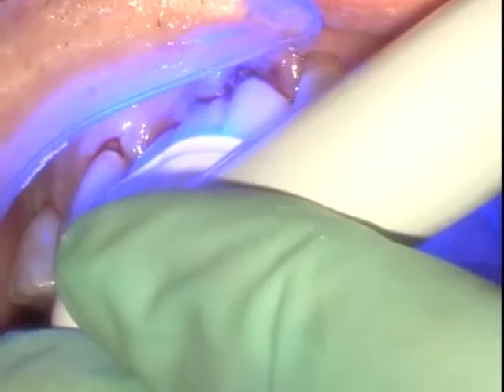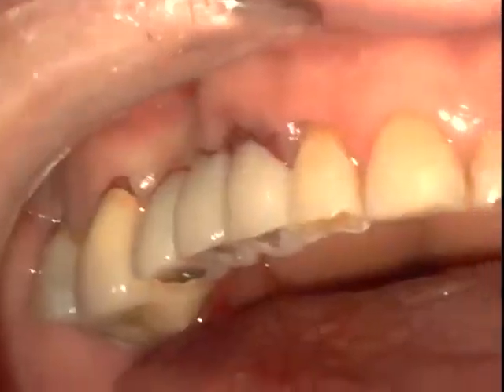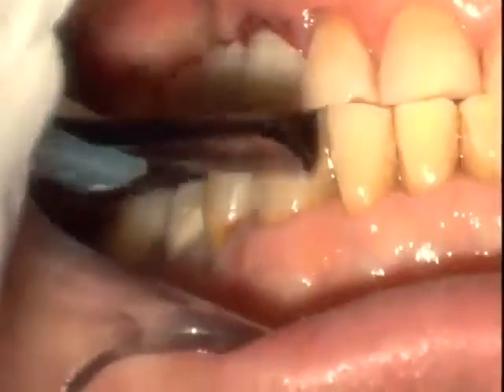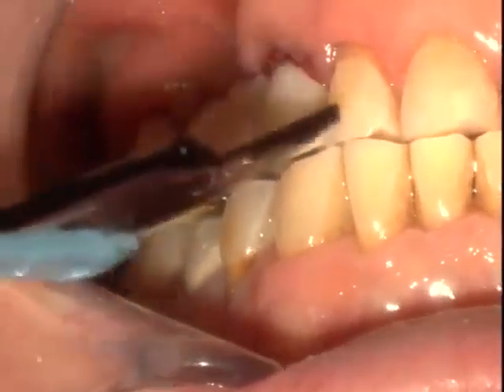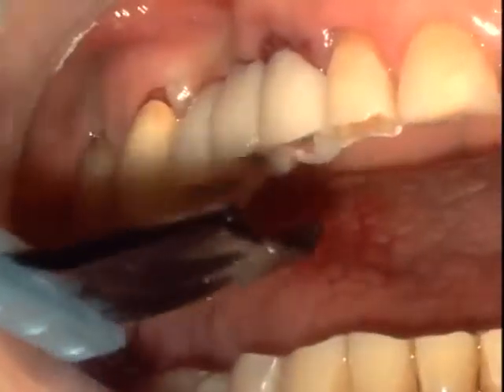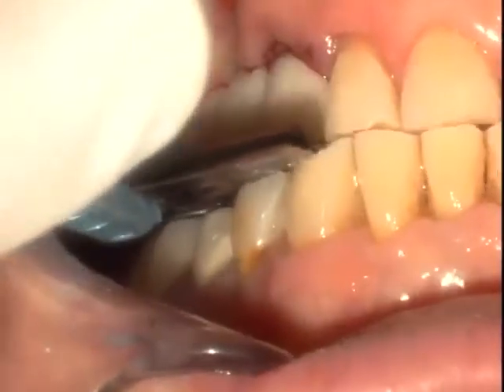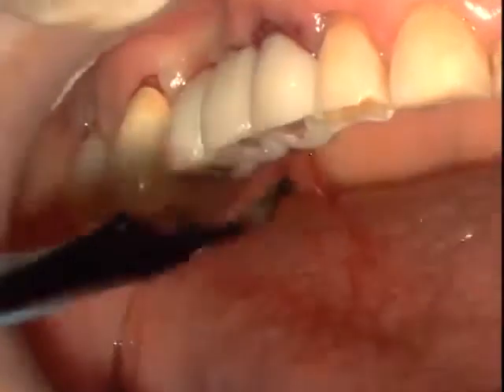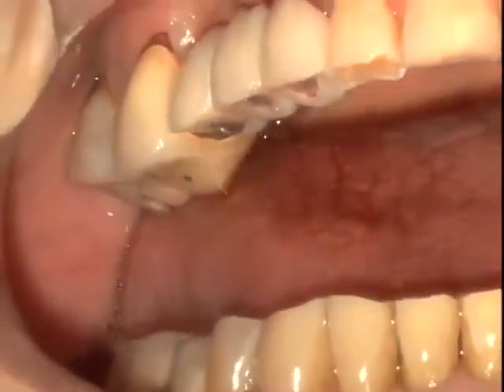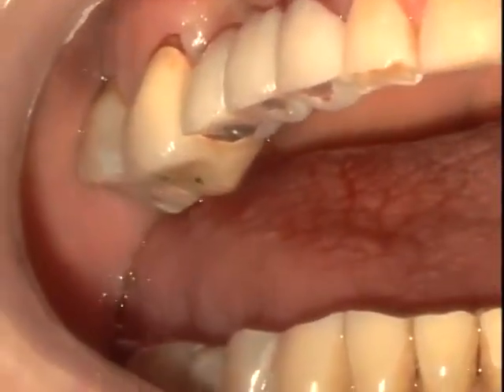So, a procedure really taken through a patient, medically compromised, who really just wanted teeth. We obviously have a ridge deficiency buccolingually, but we had enough bone present to place implants immediately, and we had enough stability, all the implants placed beyond 40 Newton centimeters, with an immediate temporary restoration being able to be inserted accurately at the time of extraction.